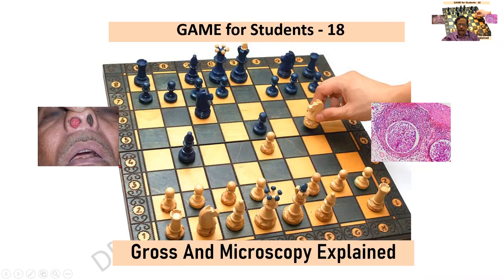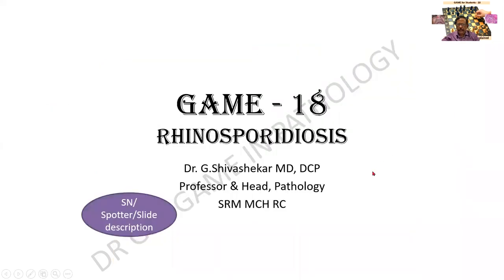I hope you are able to make a diagnosis from the first cover page itself. What is this and this? We shall be seeing. Yes, it is rhinosporidiosis. It can be a short note, it can be a spotter, or a slide for description.